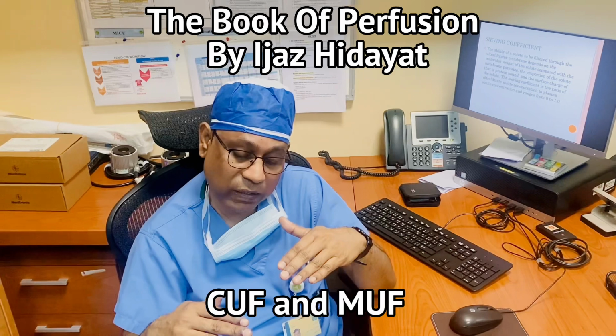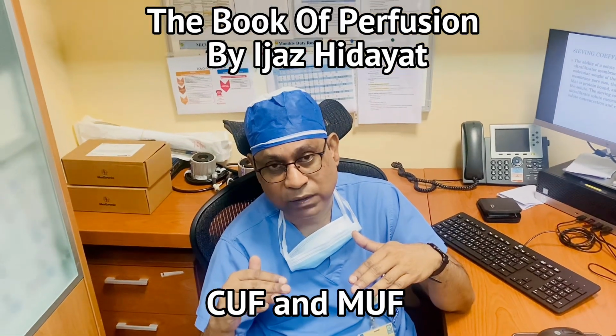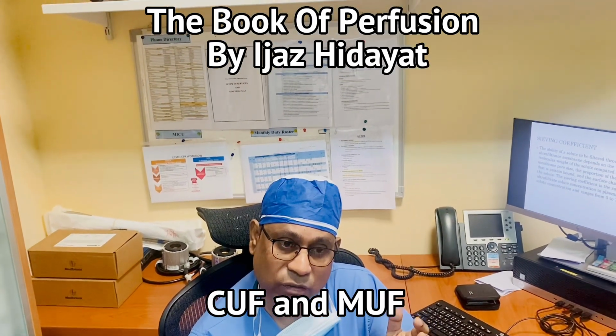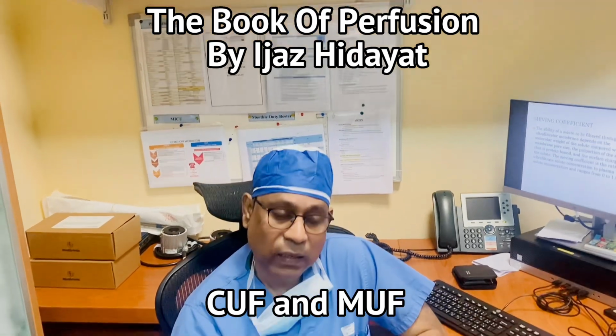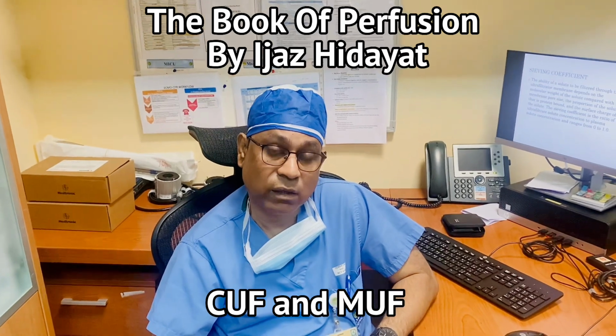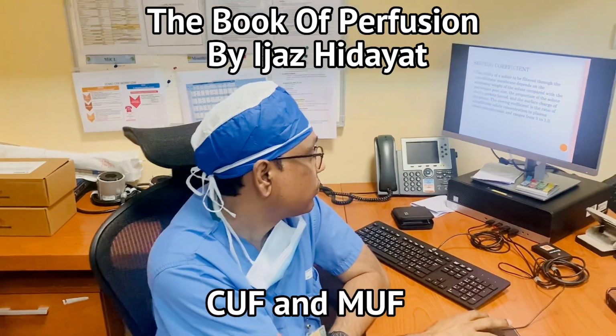Otherwise, if you keep the main arterial pump on the higher side during modified ultrafiltration, there is no use of the modified ultrafiltration. So always keep the main arterial pump on the lower side and the modified ultrafiltration on the higher side during weaning from the bypass.